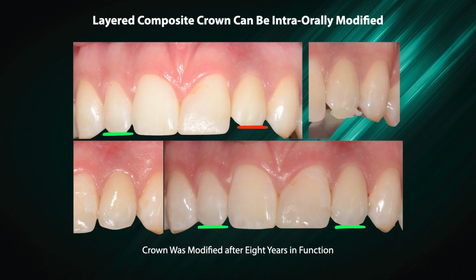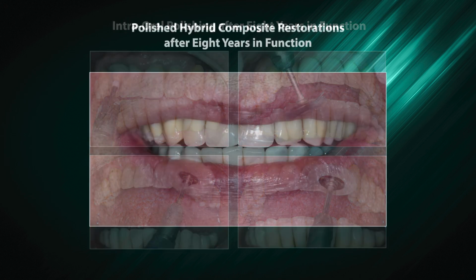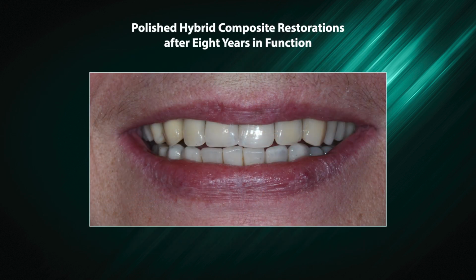Layered composite crown can be intra-orally modified. The crown was modified after 8 years in function. Intra-oral polishing after 8 years in function. Polished hybrid composite restorations after 8 years in function.